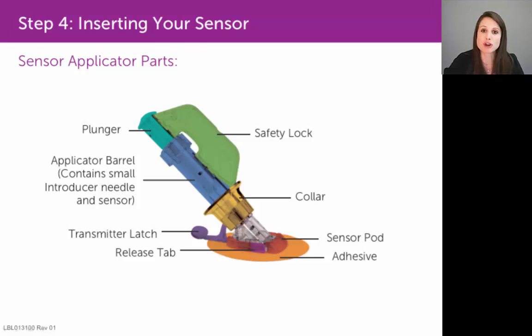You obviously don't want a sharp, rigid needle sitting in your skin for the full seven days, so you will want to remove that needle from your skin. You'll do that with the collar, labeled here in yellow.